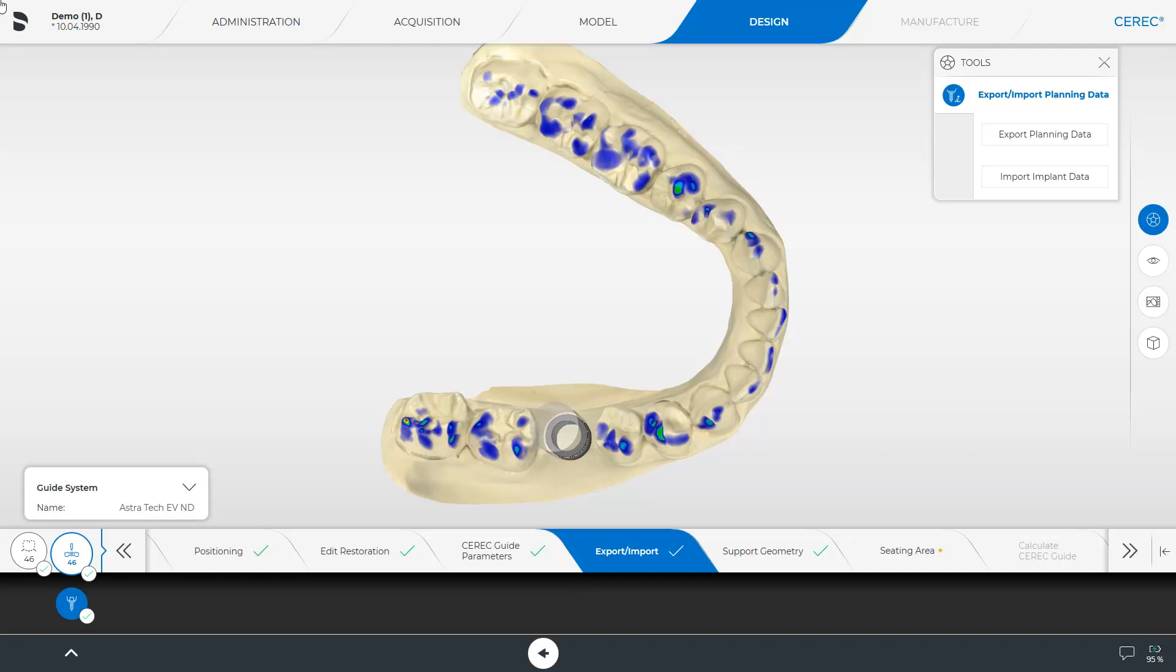We move on to the next step, which is an optional step as indicated by the green checkmark. The CEREC software has already planned the support geometry for you, and you can check this and make changes if needed.